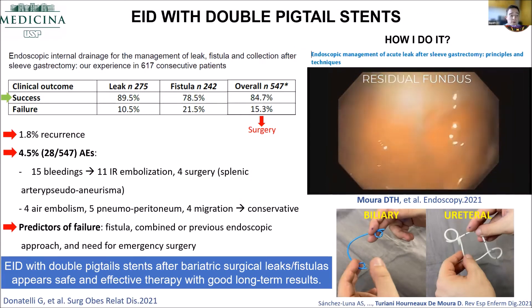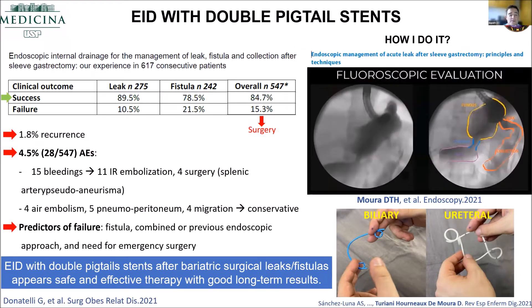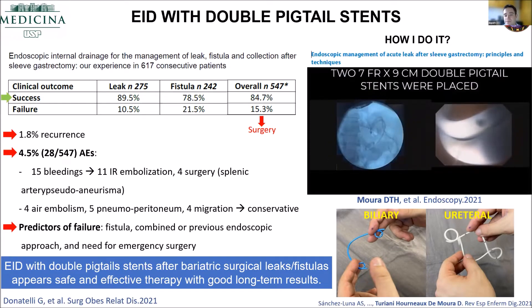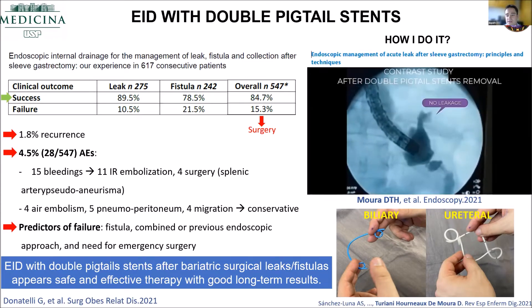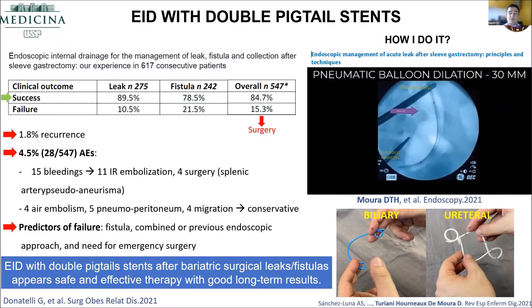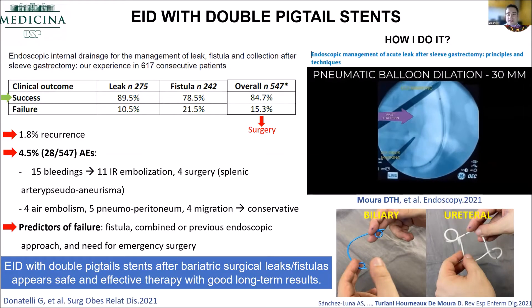Endoscopic internal drainage with double pigtail is a very interesting technique, similar to pancreatic pseudocysts. The biggest experience is from Donatelli, who published his cases with clinical success of about 85%. We show one case where we placed the pigtail stent, the patient went home and came back after one month doing okay. We removed it and dilated the sleeve with pneumatic balloon dilation. We recently published our experience using ureteral stents instead of biliary stents because the ureteral stent is much more flexible, reducing complications such as perforation, pain, and bleeding. We highly recommend the use of ureteral stents.